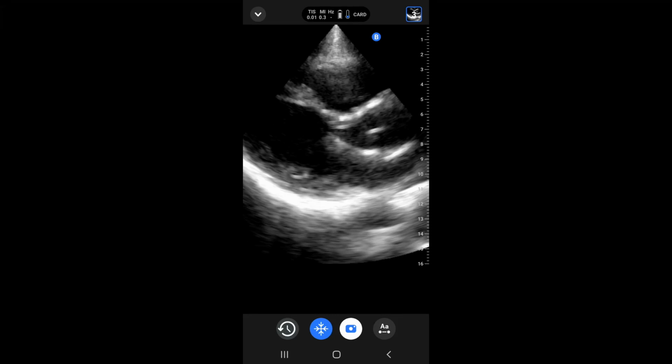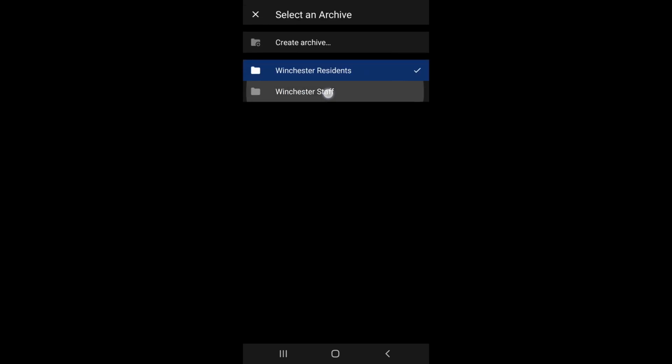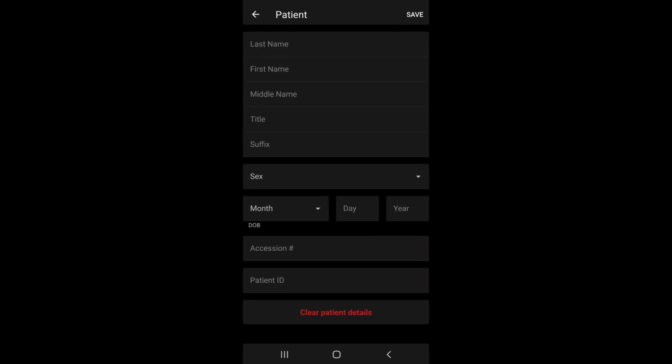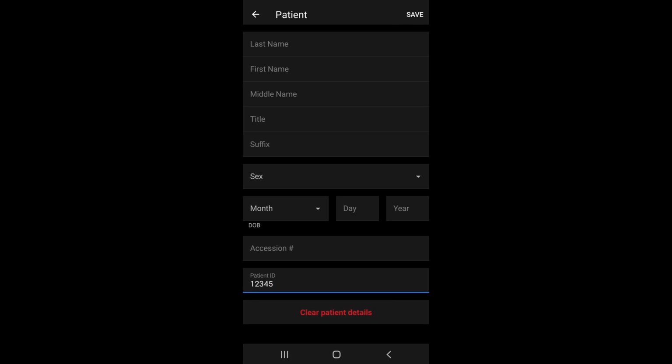Once you have that chart number, tap the blue square in the top right corner. Make sure that you're saving images in the right archive by selecting whether you're a staff physician or a resident. Then tap Add next to patient details and enter the chart number where it says Patient ID. Tap Save when you're done.